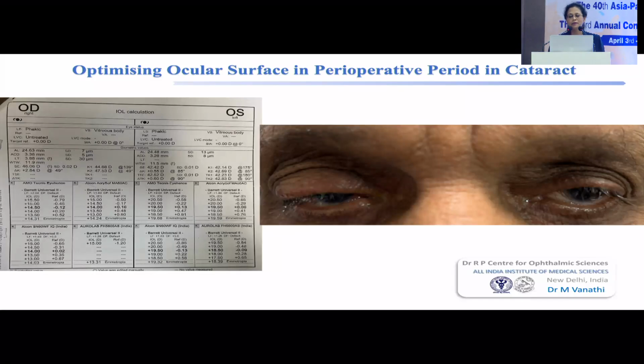Please remember, those aberrations which arise because of the lens, the lenticular aberrations, are what we can correct, because you're removing the lens and replacing it with an intraocular lens. But if the corneal aberrations are very high, these are going to be unhappy patients, because those aberrations are going to persist after your surgery, and your toric implantation is not going to correct them. So that's how you learn to evaluate in which scenario, in the presence of irregular astigmatism, you can implant a toric or not.